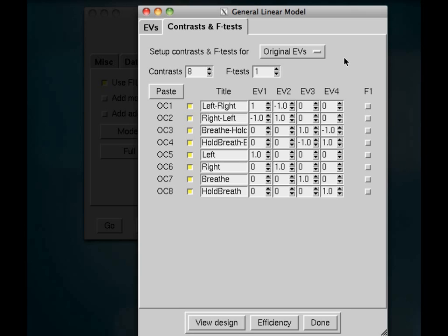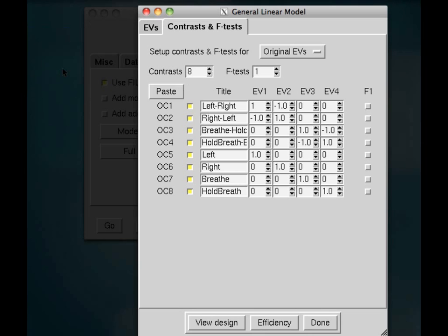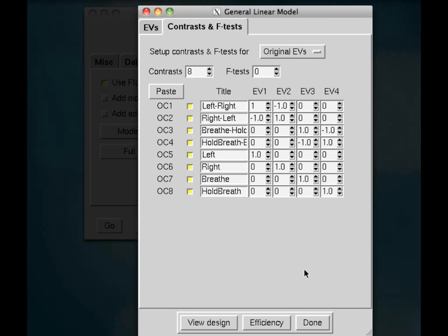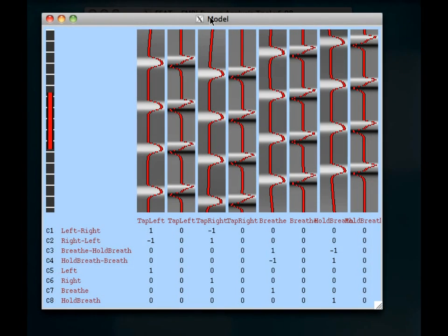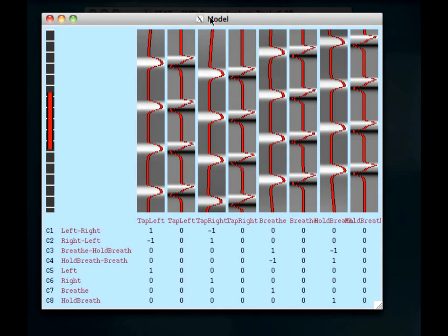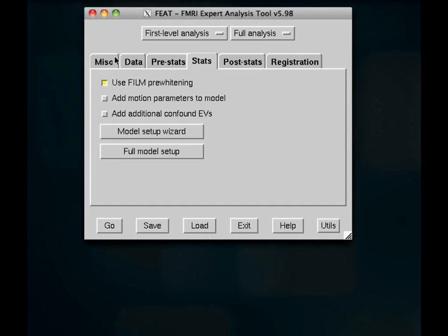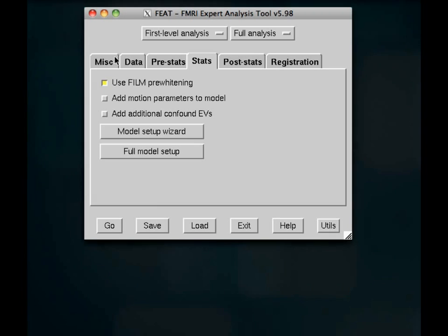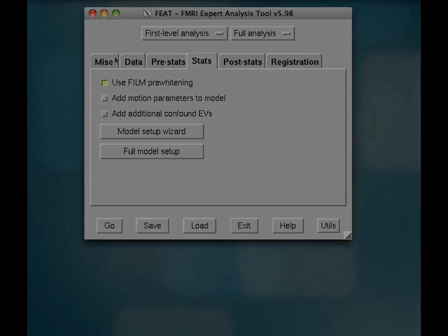So after you've done that, hit Done. And it'll automatically pop the model for you to review. So I'm going to make sure that looks good. And then you're done setting up your model with the Stats tab. So that really isn't too bad. And now we're going to go ahead and finish up the rest of the tutorial with the post-stats and registration before we run FEAT.